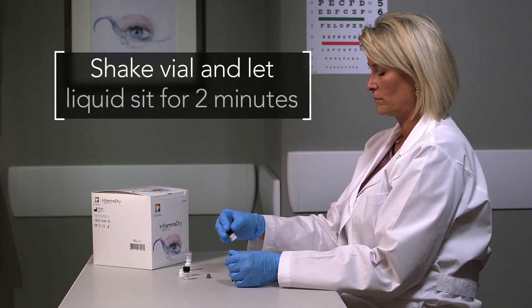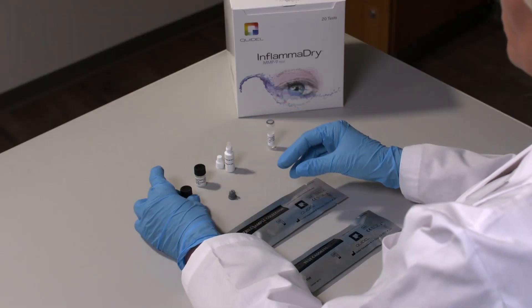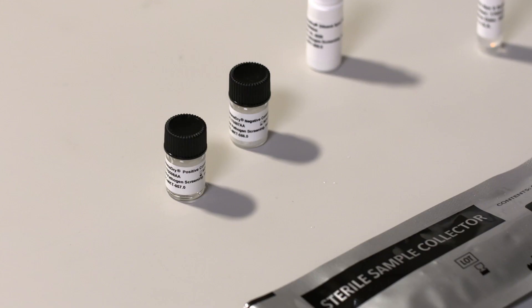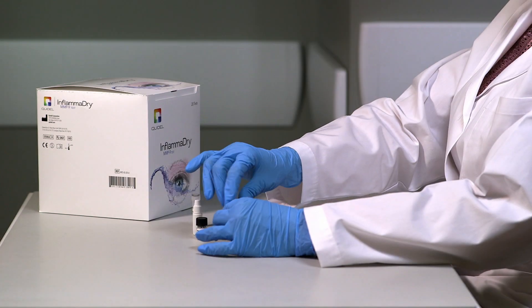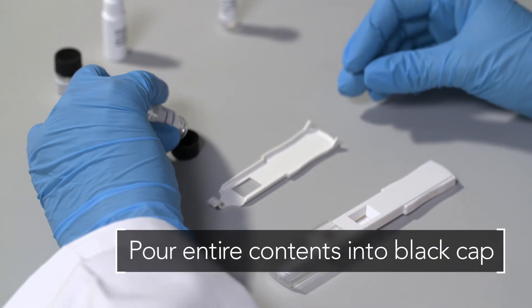Recap the control vial and gently shake the vial to dissolve the lyophilized powder. Let the vial with the liquid sit at least two minutes prior to use. Then open the control vial and pour the entire liquid contents of the vial into the inside of the black cap.